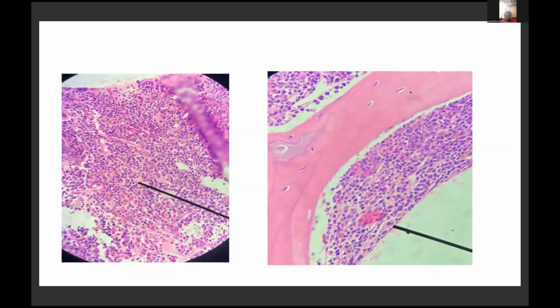Again, in the first image on the left side, you see the pointer. This is a very, very nicely regenerated marrow where the point is the low power image. What you see is a cluster of erythroid cells looking very megaloblastoid. I'm going to show this better in the next slide. In the image next to it, you see at the pointer a meg which has very small lobes.